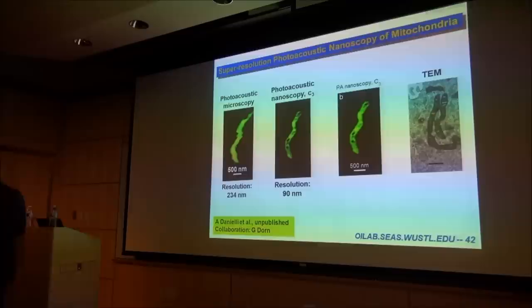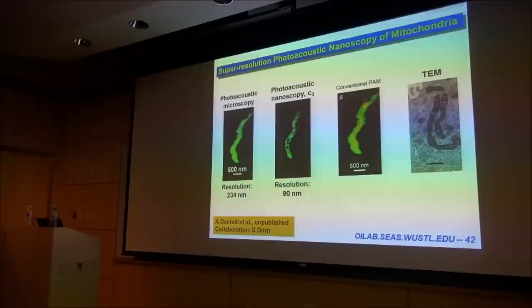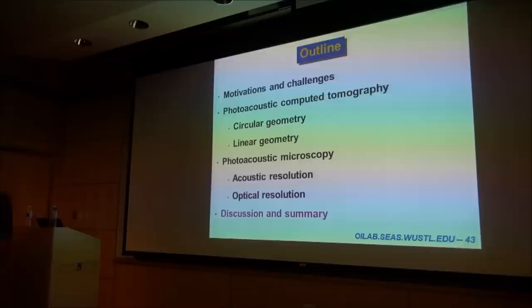We extracted the nonlinear effect out of this observation of the signal to give you this type of super resolution. And you can see the difference between the standard image and the super resolution image. So the hope is that this technology will be even more broadly adopted by biologists. Here's a quick discussion in summary.